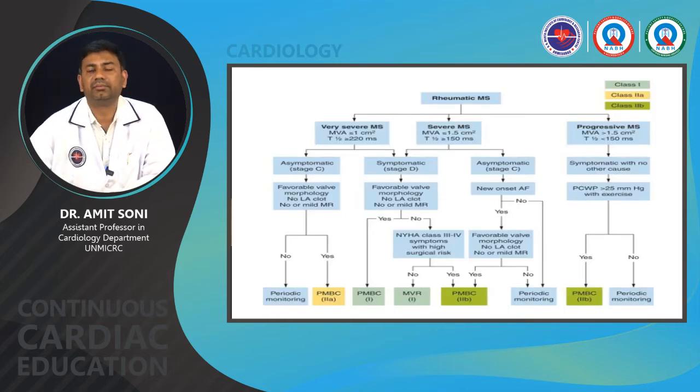So if a patient of rheumatic mitral stenosis comes to you, how do we approach?